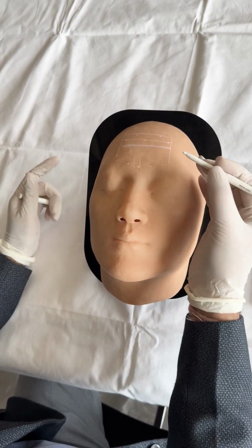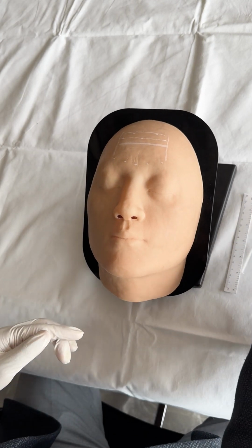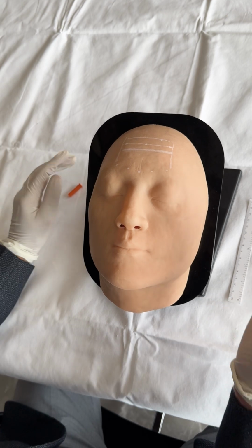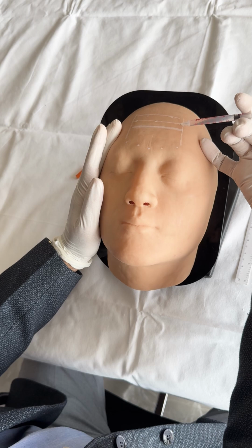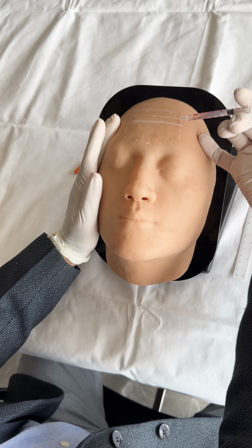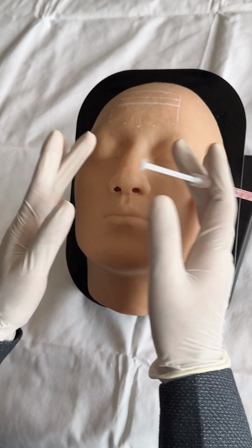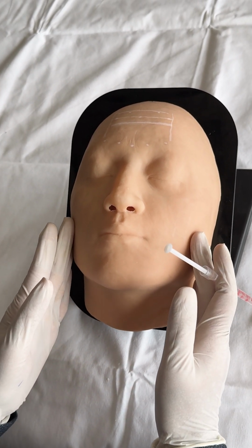Once the markings are done, we will use an insulin syringe for the demonstration of the botulinum toxin. Insert the needle to three-quarters or almost full depth of the needle and inject 4 units of botulinum toxin into one point, and repeat the same procedure on all the points marked initially. In a similar way, one can practice different injection points for the crow's feet, bunny lines, smile line corrections, masseters and much more.